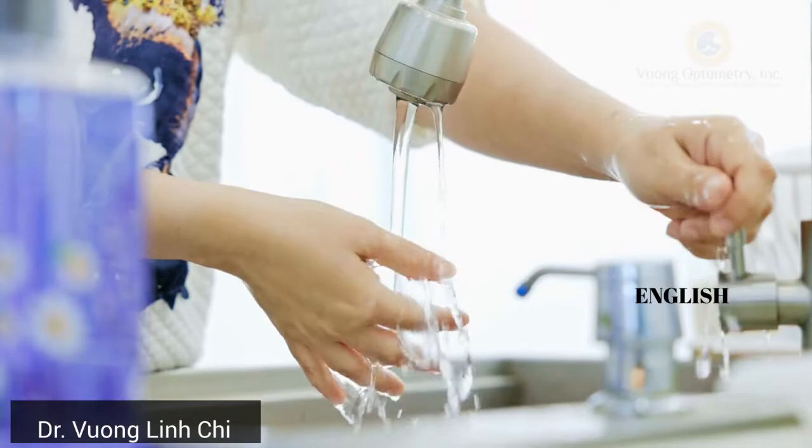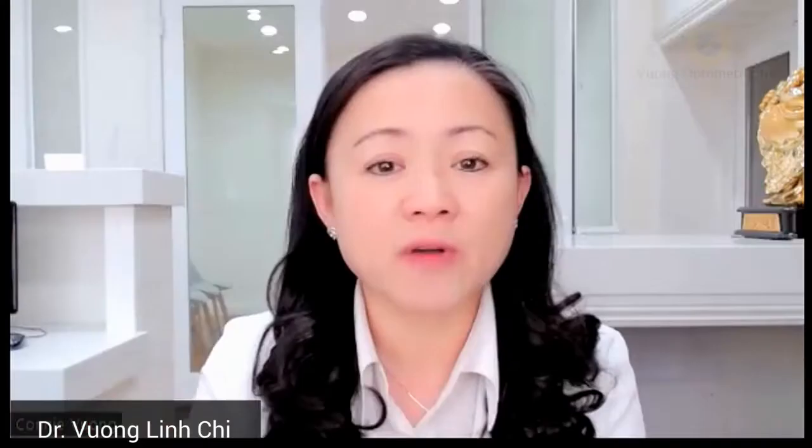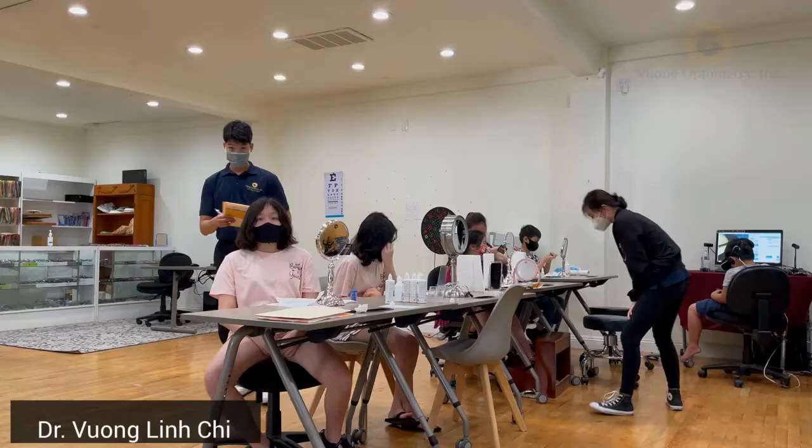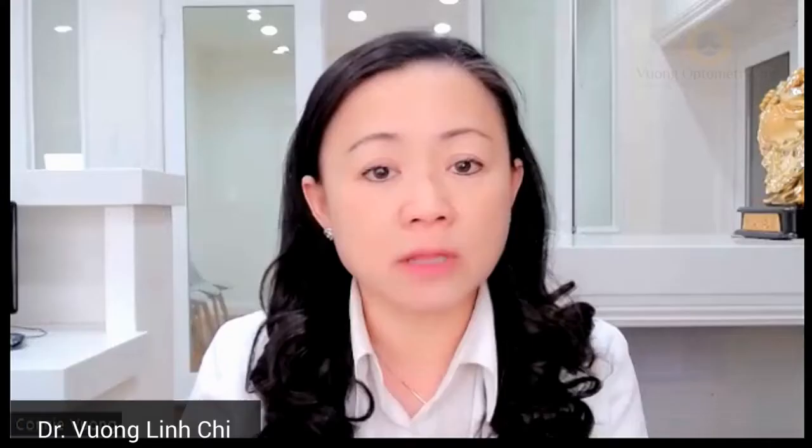When I started wearing ortho-K for my nearsighted prescription, I feel it's just amazing therapy because all I need to do is wash my hands in the evening, put the contact lens in my eye, go to sleep, and in the morning wash my hands, take the contact lens out, and I can see clearly at far, near, and computer. My practice is in an Asian community — a Vietnamese community in Little Saigon in Southern California. I share this information and amazingly, a lot of patients' parents are looking for this therapy. For the last 20 years, I have a lot of patients doing ortho-K mainly for kids who are nearsighted because their glasses are getting thicker and thicker and the parents are worried that they have complications due to increased prescription.